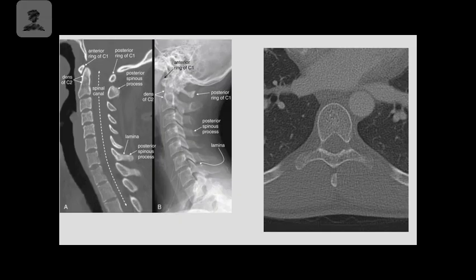And something that's nice is we can take an entire chest CT and break it down and make a new field of view, which would be the display field of view. That's the only thing that you can change. And you can send through an entire new data set only looking at the spine. You have all the chest information, you've already sent all that through, but you can go back and cone down to the spine if that's what they want to see a little bit better.